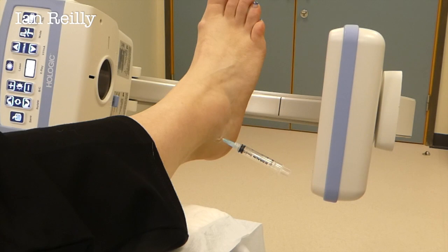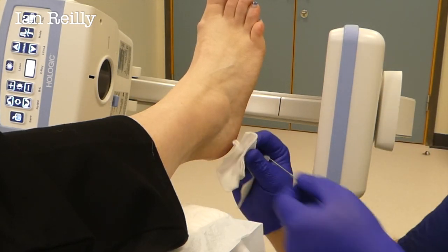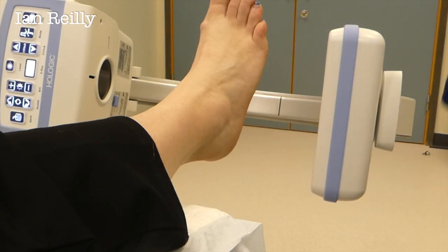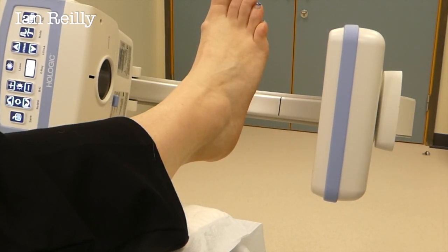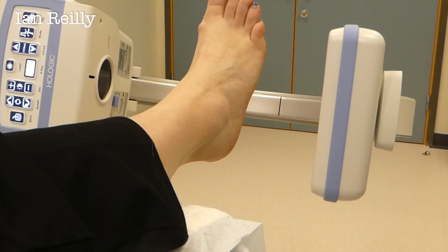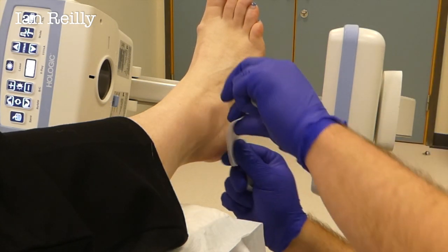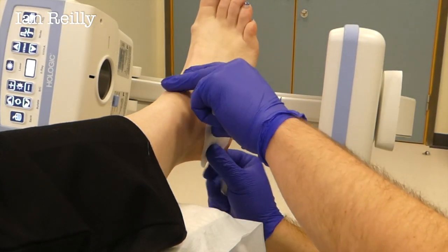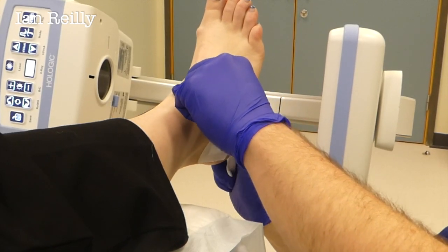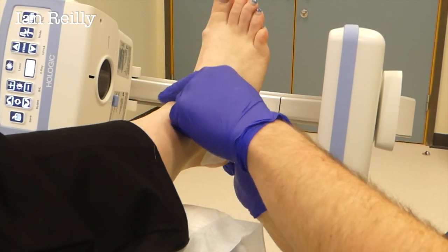So, Rita — what we're not going to do, see that syringe there? We are going to take that out, otherwise you won't be able to get your shoes on. We'll make sure we re-sheathe that needle. So, George, just for the camera, just remind everybody what the injectate was for that particular one. So, we're putting around there 40mg of Depomedrone with lidocaine.